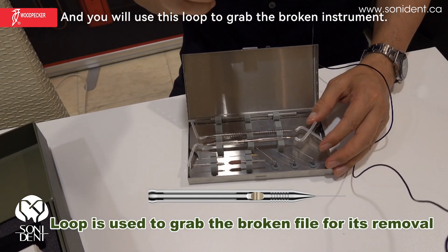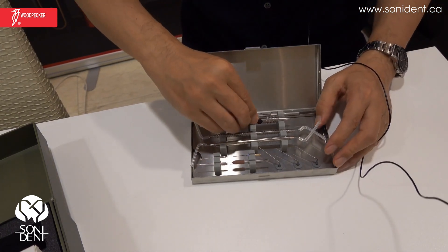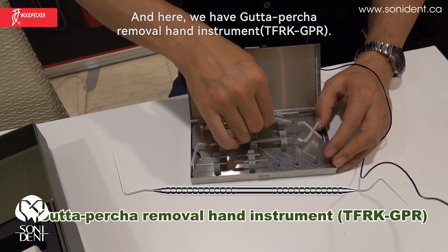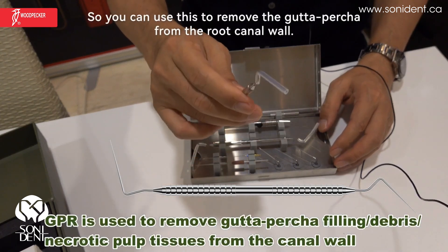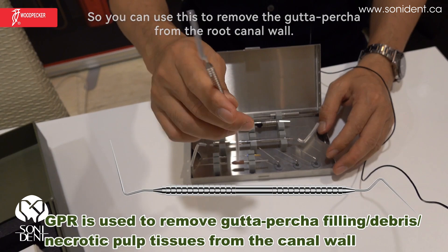You will use this to grab the broken instrument. And here we have the gutta-percha removal hand instrument. You can use this to remove the gutta-percha from the root canal wall.